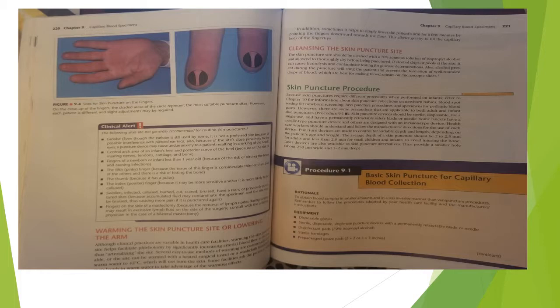Procedure 9.1, basic skin puncture for capillary blood collection. Rationale: to obtain blood samples in smaller amounts and in a less invasive manner than venipuncture procedures. Remember to follow the procedure adopted by your healthcare facility and the manufacturer's instructions.